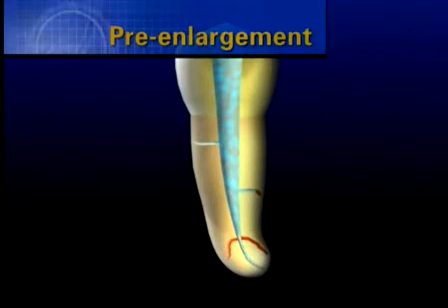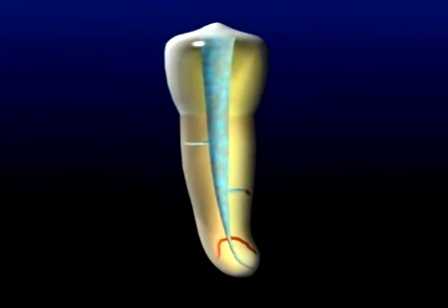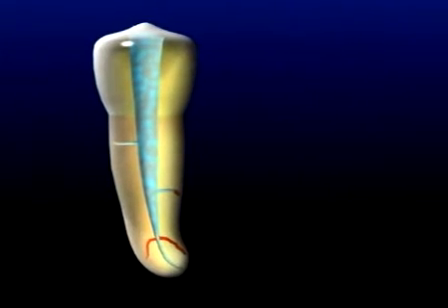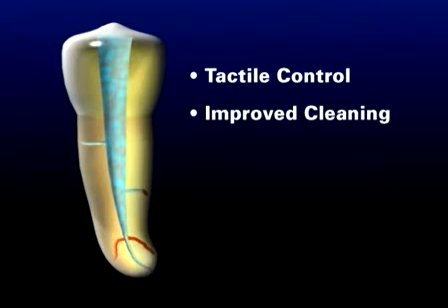The pre-enlargement of a canal can be accomplished with just one or two ProTaper rotary shaping instruments, and the more important breakthroughs are: pre-enlargement gives the clinician better tactile control when directing small pre-curved negotiating files into the delicate apical 1/3 microanatomy. Pre-enlarged canals hold a greater and more effective volume of irrigant, which serves to enhance cleaning. Pre-enlarged and tapered canals dramatically promote the removal of dentine mud.